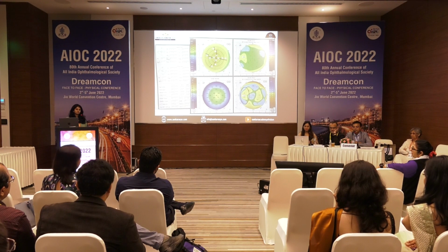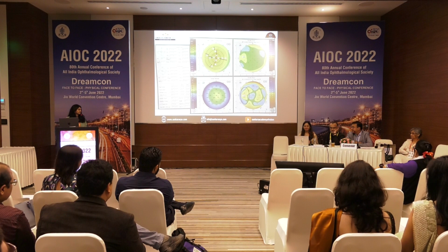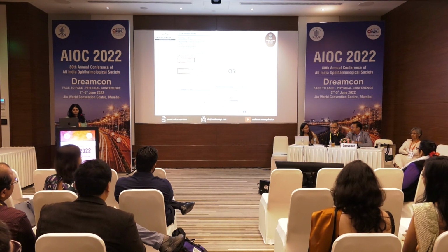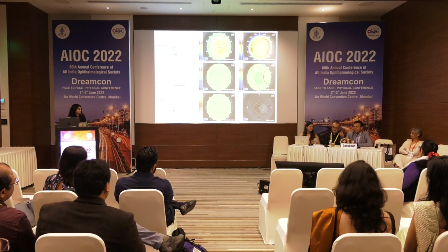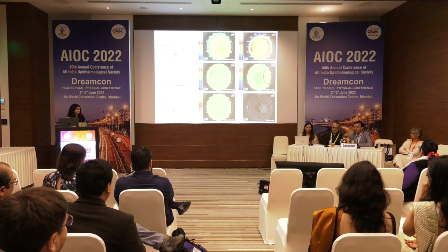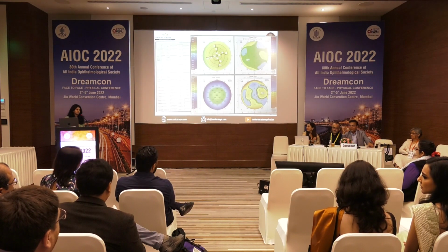So probably it's artifact. Sir, would you do a SMILE Xtra for this patient? I probably would, yeah. Whenever in doubt, if you're doing a SMILE, you can switch to SMILE Xtra. So SMILE Xtra would probably be a wise choice here because SMILE still remains in a gray zone. For the sake of discussion, we could do that, but if you have to give a message to the audience, I think it would be ICL. So thank you so much. Thank you.